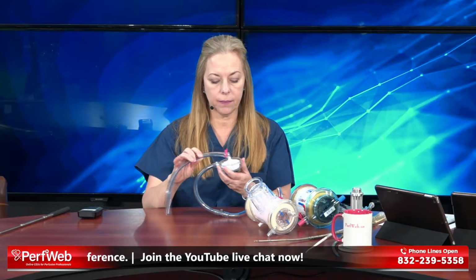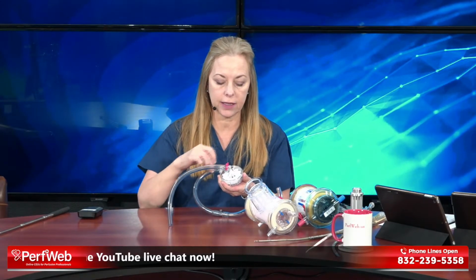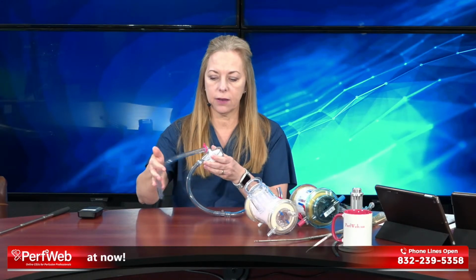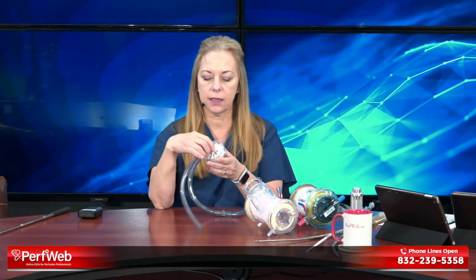And you can see it's similar to most centrifugal pumps. It has a lot of little fins here that spin around and propel the blood. Of course, coming in through here would be the access from your patient into the blood pump, out of the blood pump, and into whatever oxygenator you choose.